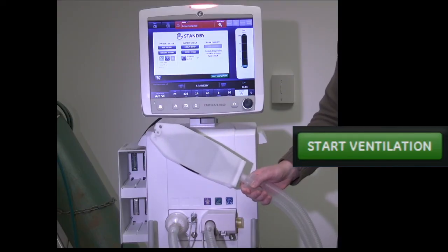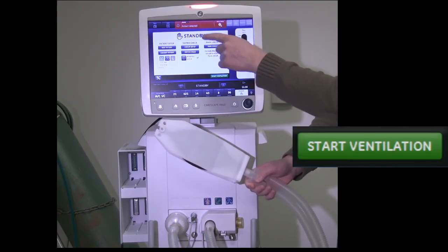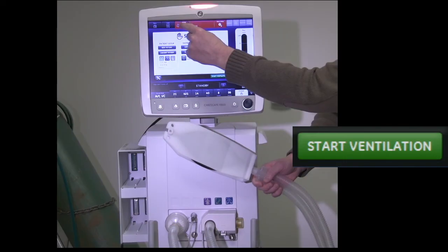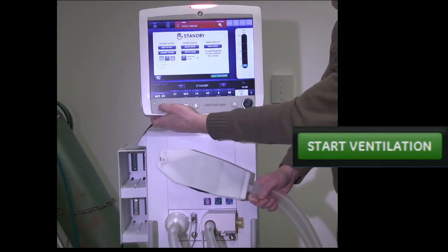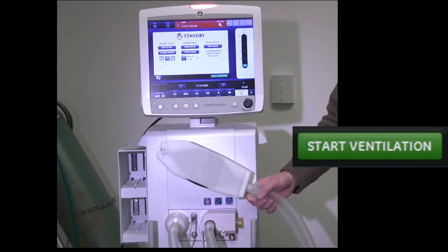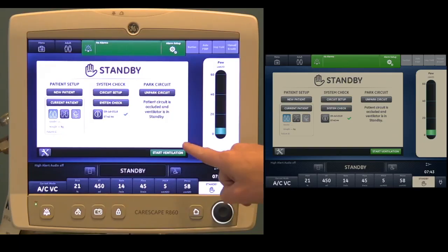I'm just going to get this very high risk alarm that my patient's connected, and I cannot silence the alarm by either pushing the display silence or even the hard key. So that's why this button's the most important thing.